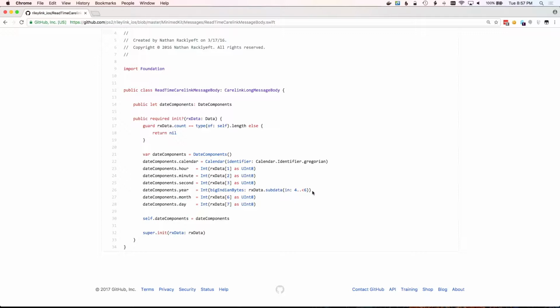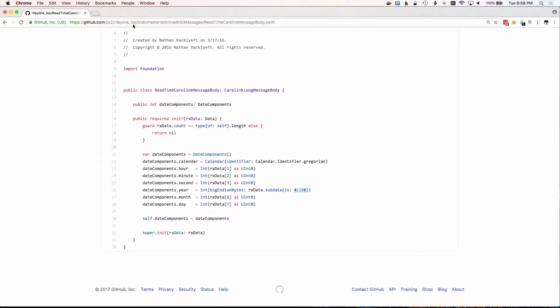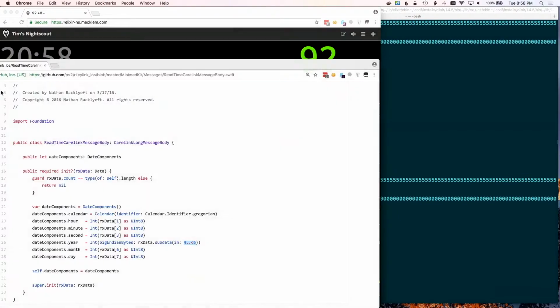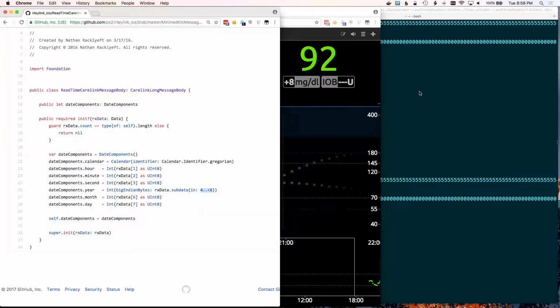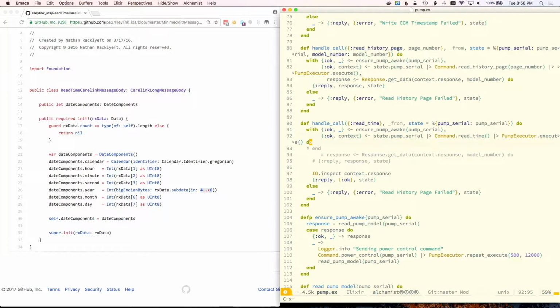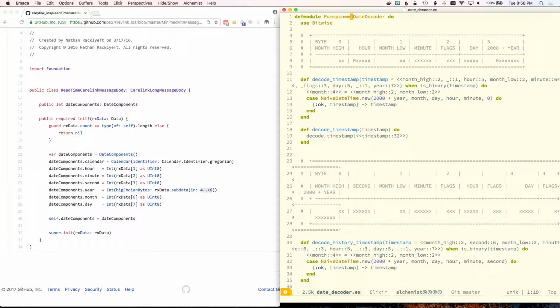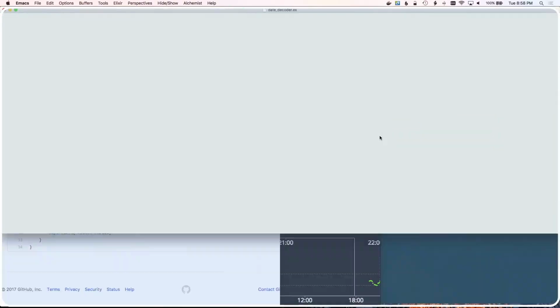And then, I'm not sure exactly what the range looks like in Swift. I can't remember that off the top of my head, but we've got a year, and then we've got month and day, which I think looks relatively similar to some of the other date time stuff. So I'm going to try to see if I can marry those two things up. So all of that lives in date decoder. I better just make that full.